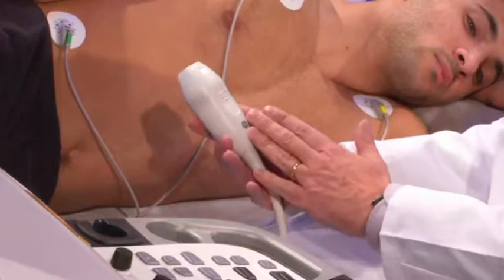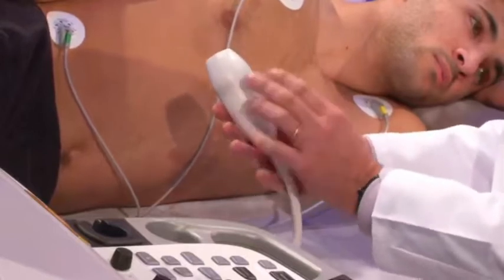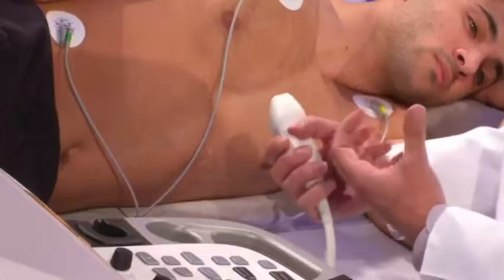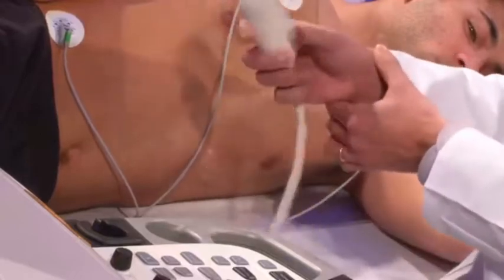It allows acquiring and analyzing every structure from every point of view. For that we need a specific probe, and this probe is slightly bigger than the usual probe used for 2D. This may give some limitations because of the size — it's sometimes difficult to have a good window. If you have a small patient, you may have some difficulties due to a small intercostal space and you cannot avoid some rib artifacts. Moreover, the probe is quite heavy, so it might sometimes be difficult to make a complete examination.